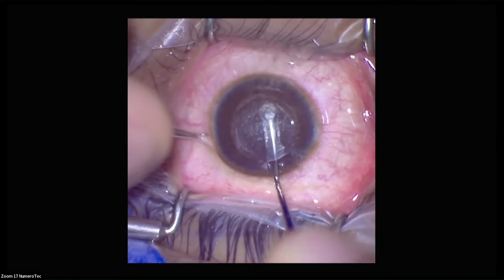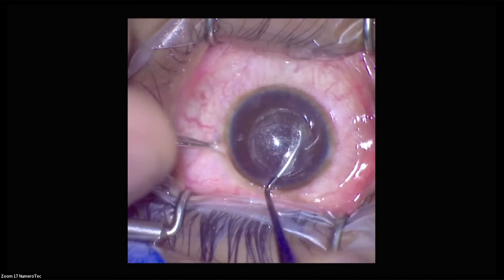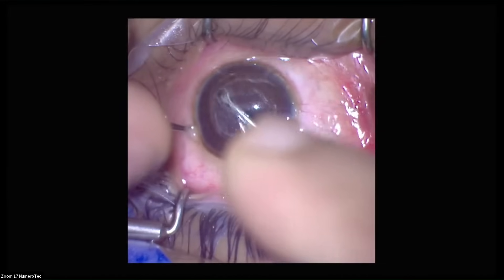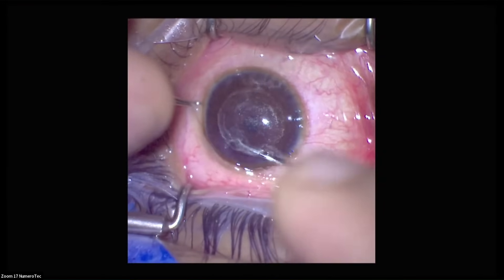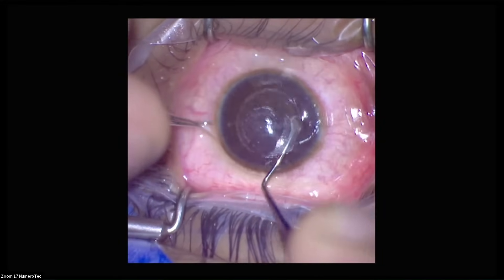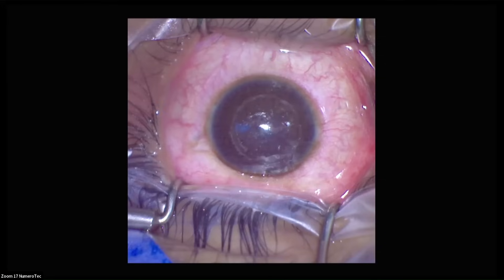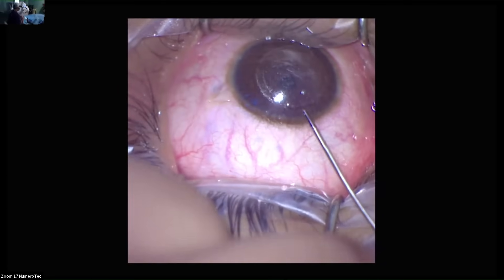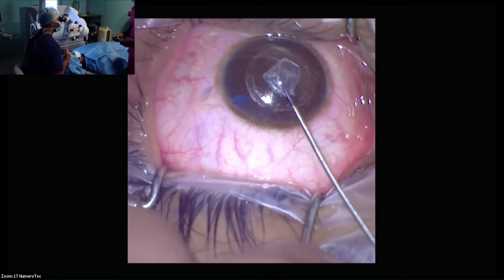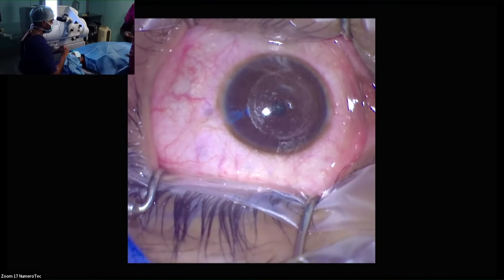So that's the central dissection done. Now I've poked out and cut the edge of this part, moved about 4 or 5 clock hours over here, left that intact, left a central island, and poke out again. Now cut out the edge completely right up to the subincisional area. Cut out the superior few clock hours and finally take this undissected part. So that's the lenticule come out now. If you're a beginner, it is reasonable to spread this lenticule and ensure that it's complete. Thank you for that excellent demonstration.